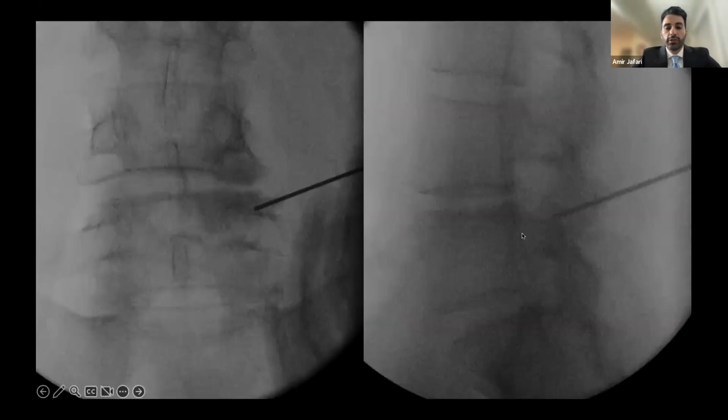So we took her for endoscopic decompression, and this is the X-ray imaging of the procedure. We use fluoroscopy. Obviously, we also have a scope and a scope tower we're looking at. A combination of a live view on the camera and fluoroscopy really gives you good visualization. First, this is a stylet we put down, and it's placed at the junction of SAP.